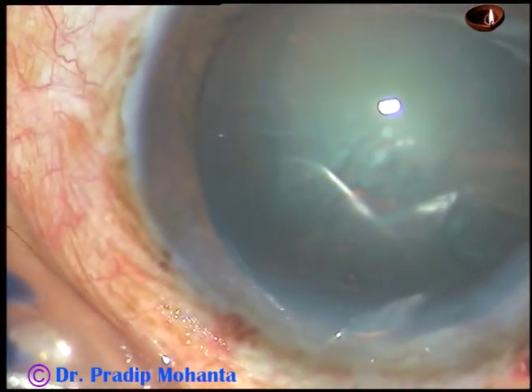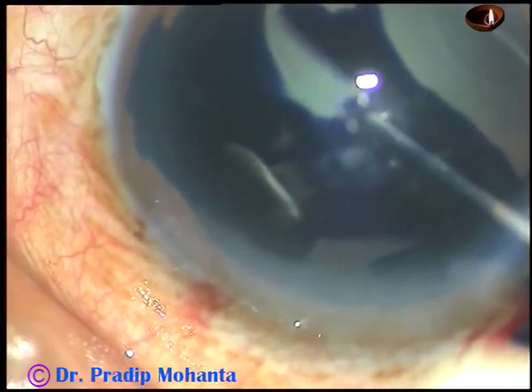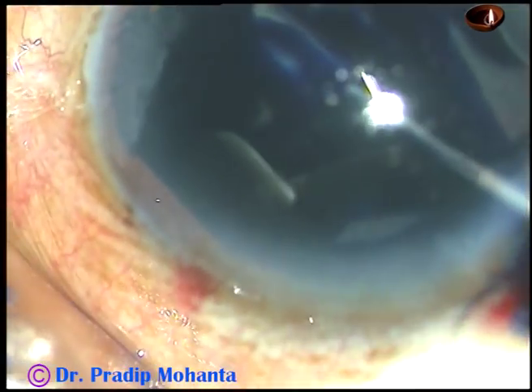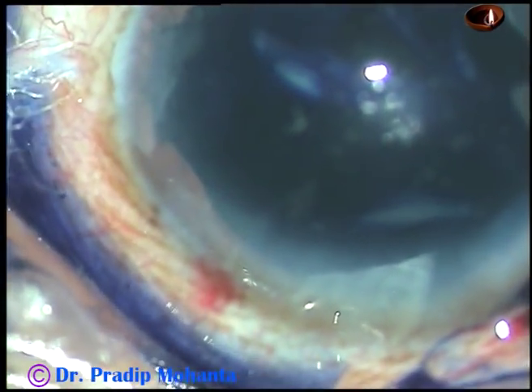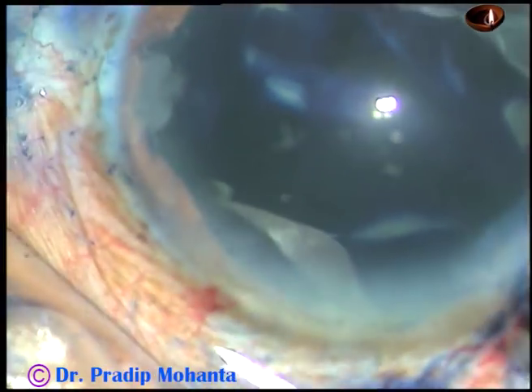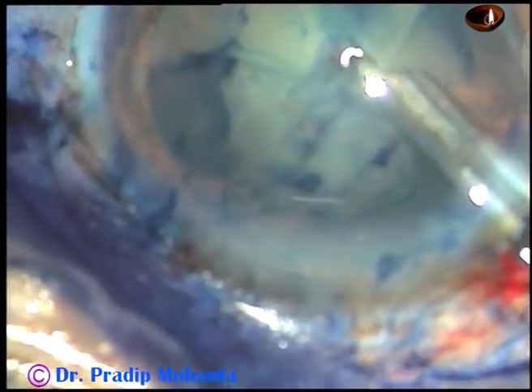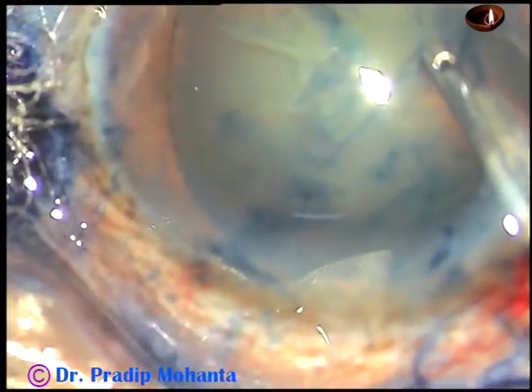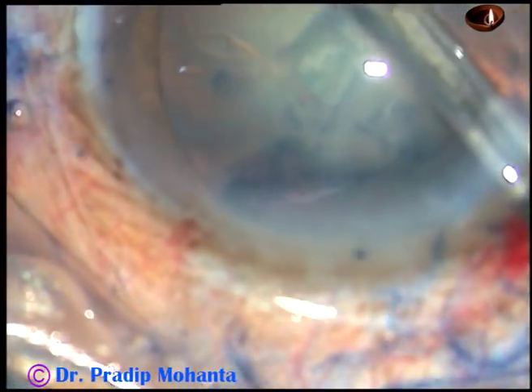What we do is just paint the anterior capsule and inject the dye, just touching the capsule. Touch the capsule and inject the dye. In this way you paint the capsule with trypan blue dye underneath viscoelastic substance. Staining is not as good as it can occur under an air bubble, but this gives some amount of staining and it helps.